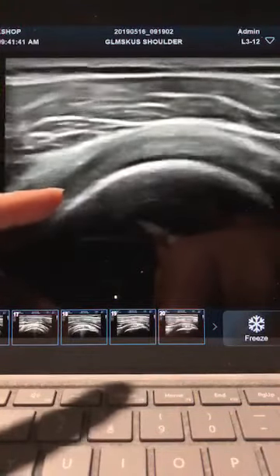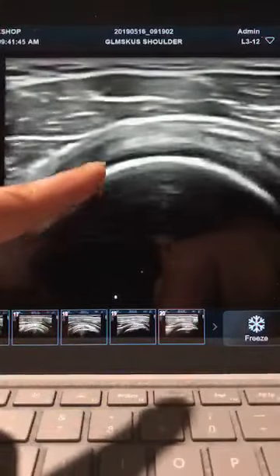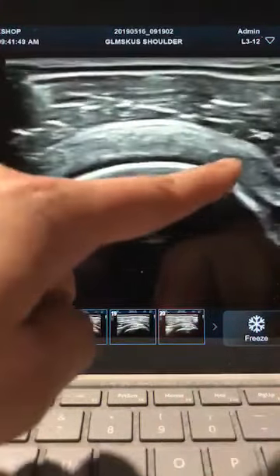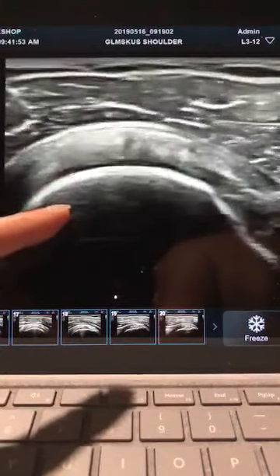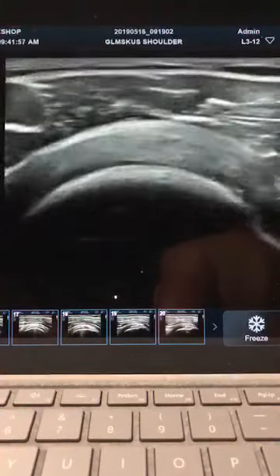This is very important to me because you can have isolated tears just within the segment that may not be affecting the posterior segment or the anterior segment as the tendon inserts on the greater tuberosity. Scanning that to the tuberosity here, it may reflect as normal.